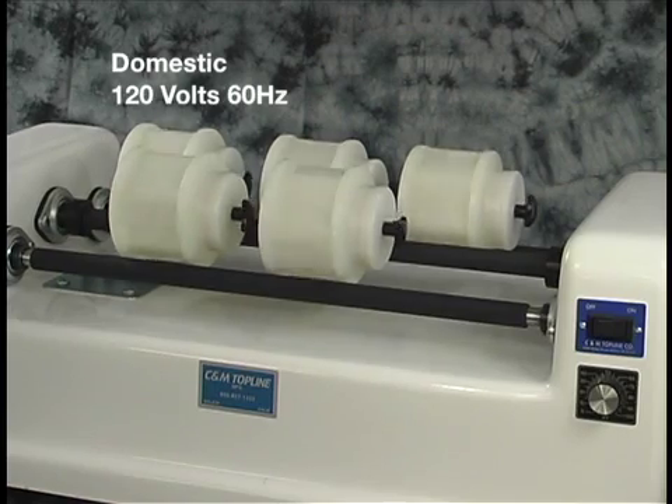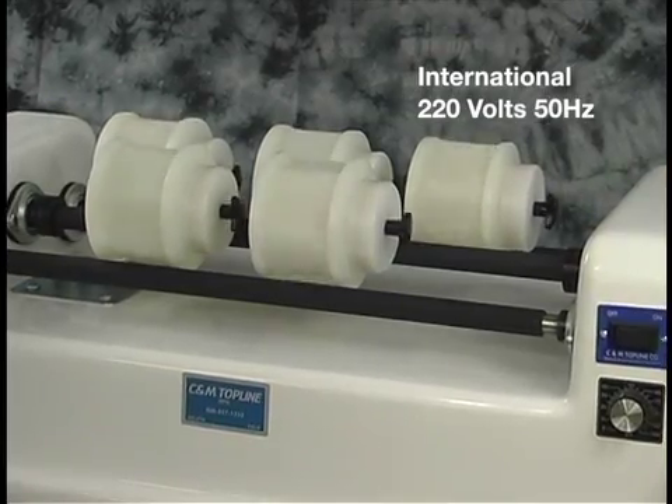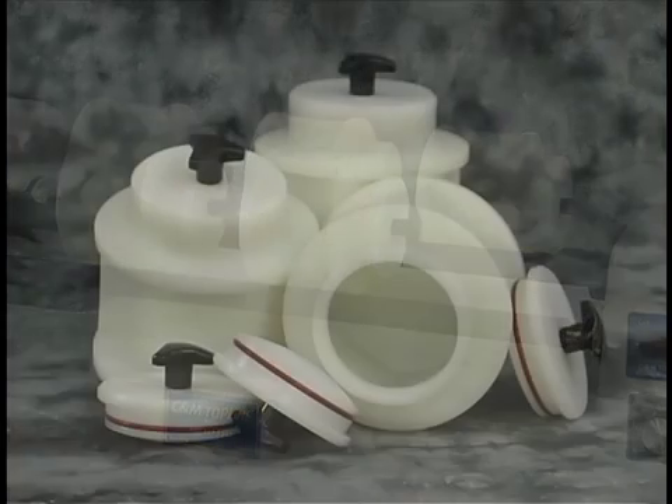The voltage can be 120 volts, 60 hertz, or international voltage of 220, 50 hertz.